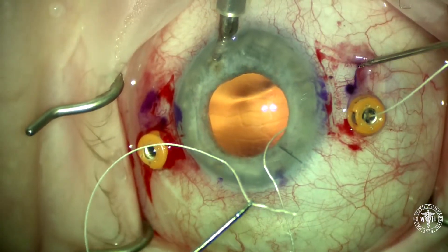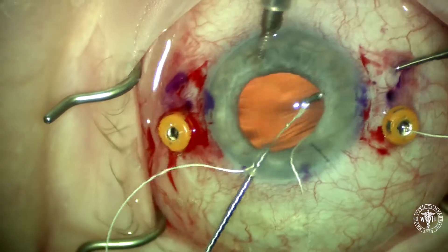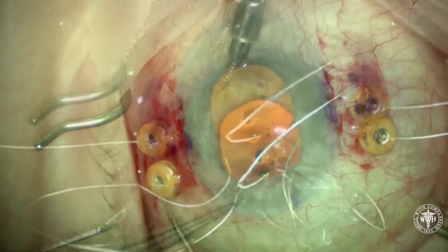I'm a little off the field here, but I'm lacing a Bausch + Lomb A060 lens — I'll show that better later in the case — retrieving the second half of the suture through the more distal sclerotomy.